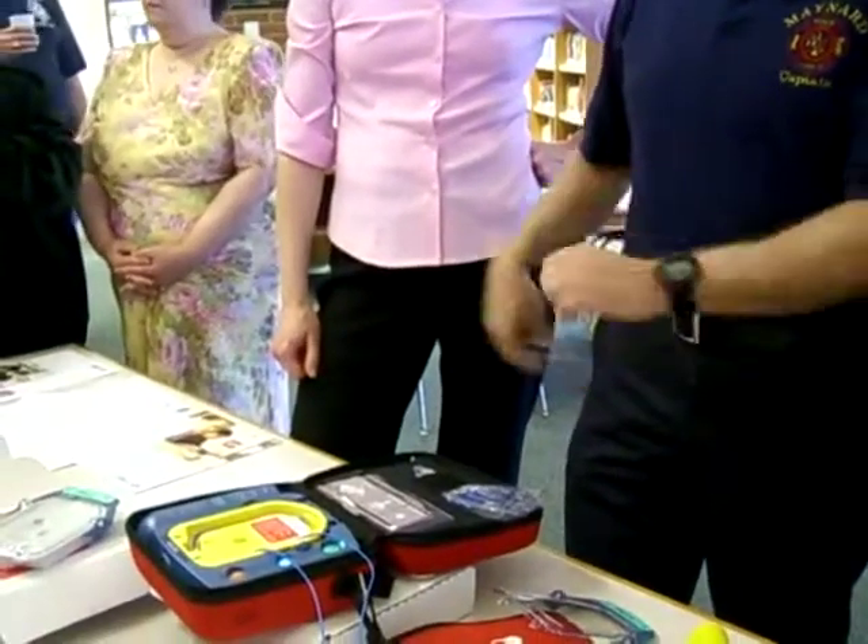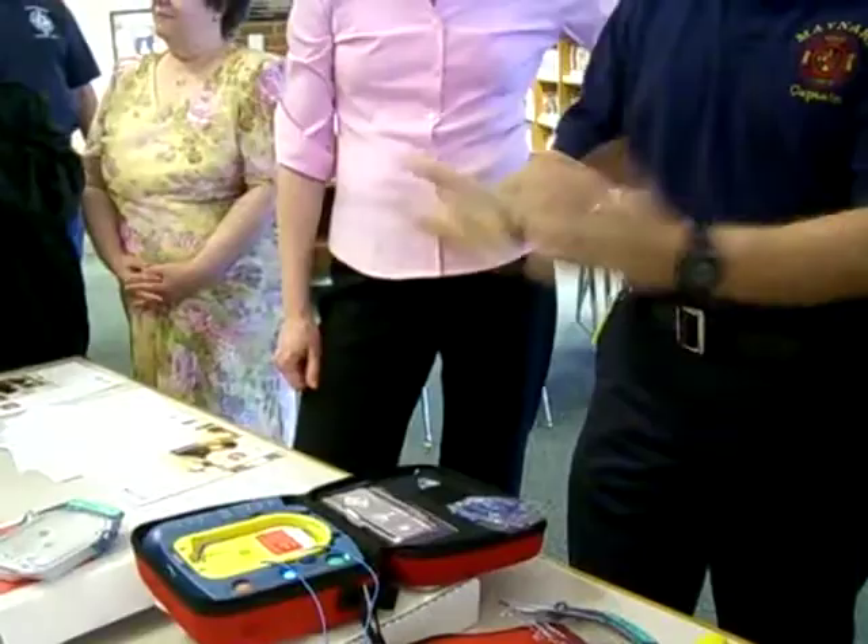Push the chest down firmly two inches. The machine even times your CPR for you.